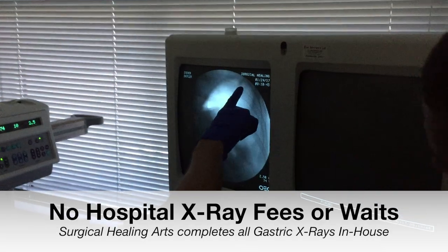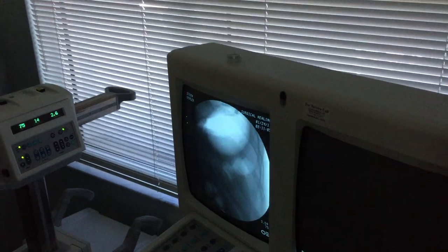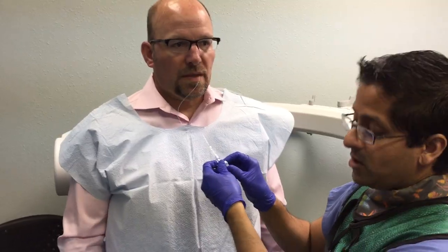Okay, here's one, here's two — that's your balloon. That is the new one. Perfect, let's get you attached. We're set right there. Lights on please. Alright, we're going to go on.